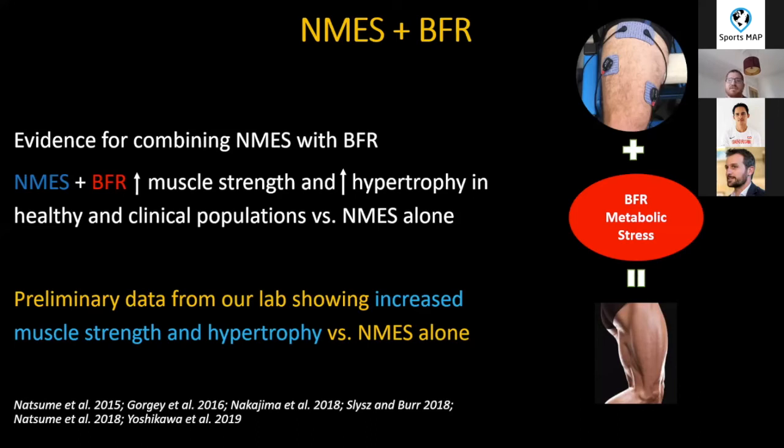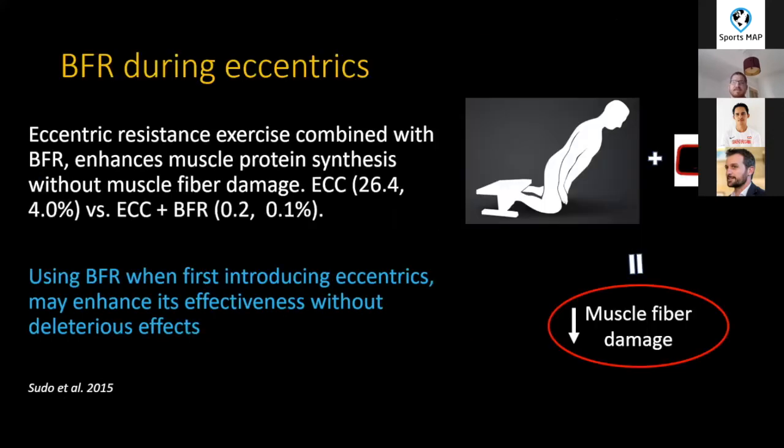But one thing I would say is when we're looking at acute muscle injury management, we don't know what the combination of electrical stimulation and BFR has on edema formation, as I touched upon earlier. So if we're looking at acute management of muscle injuries, I just apply electrical stimulation on its own for 2 lots of 20 minutes daily. But when reducing edema is not a treatment goal, then I would combine the 2, looking for greater muscle adaptations.